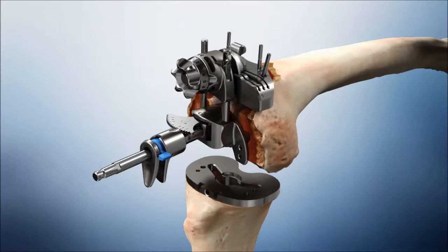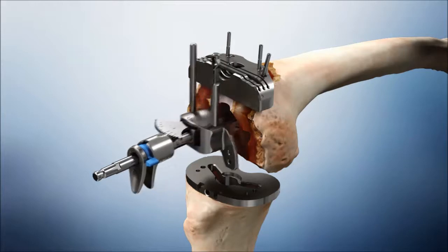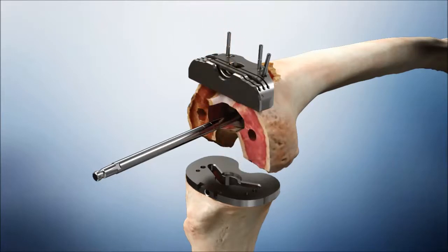Use a thumb and index finger to release the distal cutting block connector from the cutting block. Slide the femoral resection guide upward on the alignment guide legs until clear of the block, and then pull the femoral alignment guide distally over the removable shaft. Make the appropriate medial and lateral distal resections. Remove the pins and cutting block.